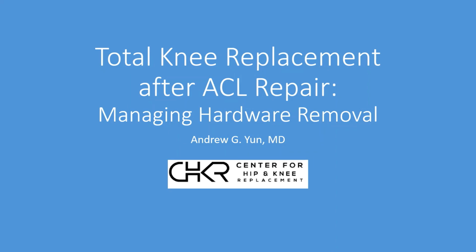Removing hardware is a non-trivial task. Much of this hardware has been in for 15 to 20 years and buried under layers of bone. If the hardware needs to be removed, then we need to remove the hardware, no matter where it is. But if the hardware is not in the way, then it's much safer to preserve the bone and soft tissue and the integrity of the surrounding area.